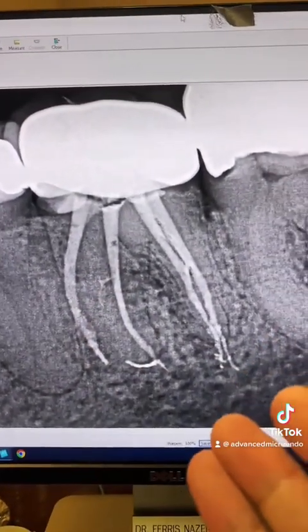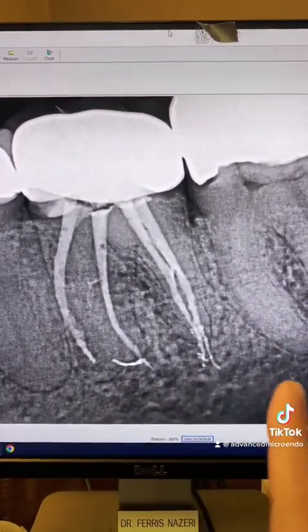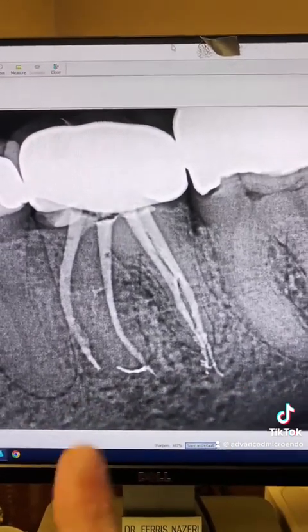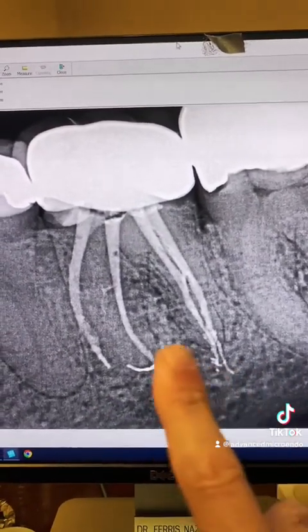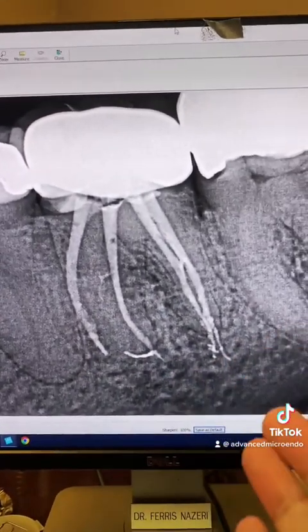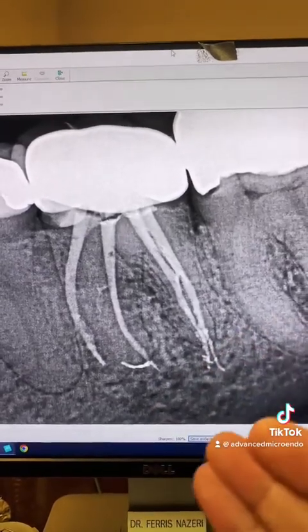I'm not using anything special here, by the way, guys. I didn't even use NiTi files. This is all hand instrumentation and reciprocation using stainless steel K files and the reciprocating handpiece. Sonic activation. I'm not using lasers, or a GentleWave, none of that stuff.